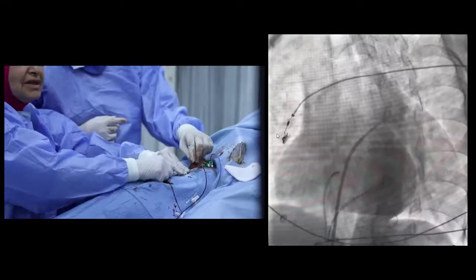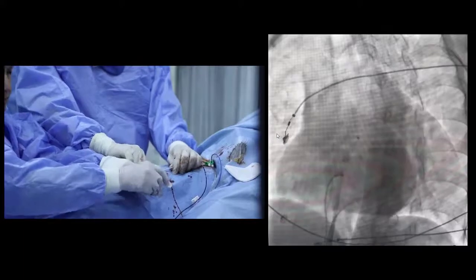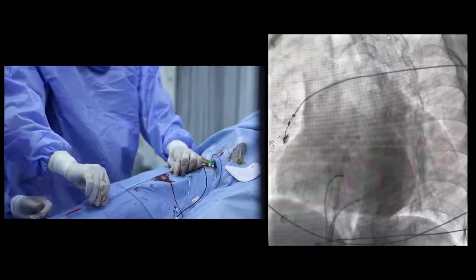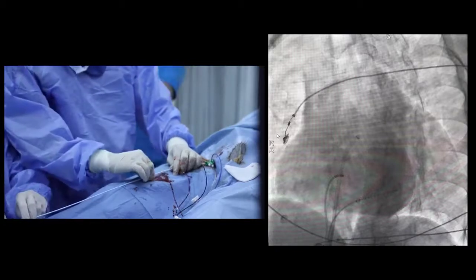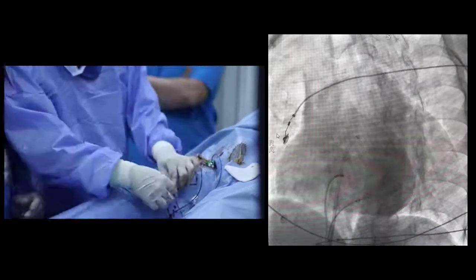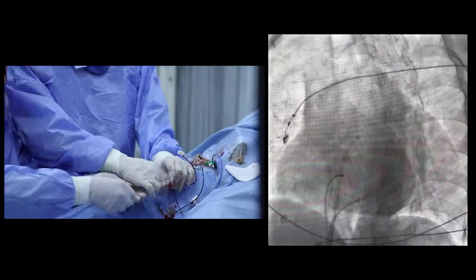And now we see the long wire in the pulmonary vein. Then we withdraw the dilator and the long wire, with the long sheath ready to receive the non-irrigated catheter to start mapping the mitral annulus.